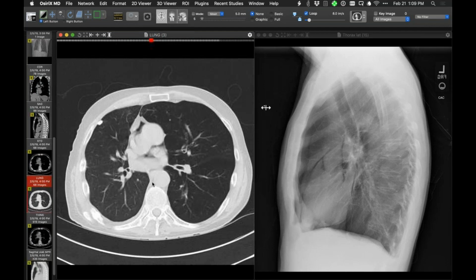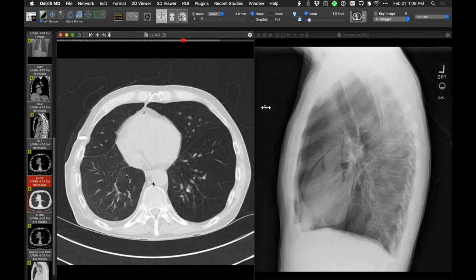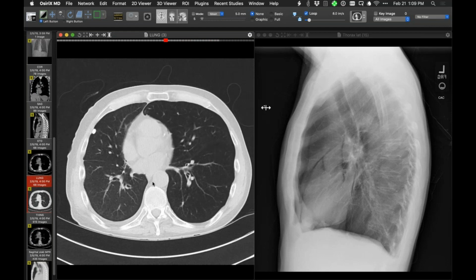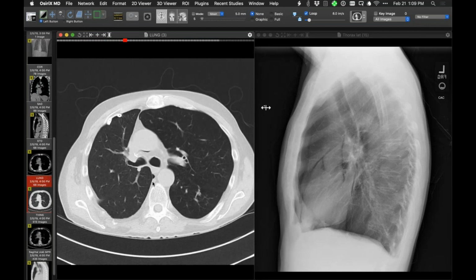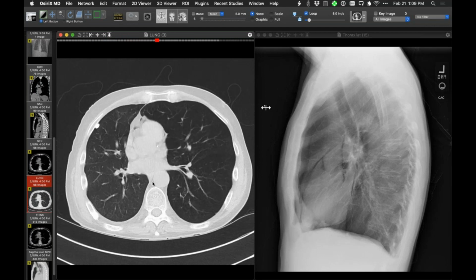So that at least there's a potential for Pneumomediastinum to go to the pleural space, or to be a communication between pleural space and mediastinum after transplantation, as well as potentially pericardium. Is that right? Yeah, you would probably get all three, because there are surgically created communications between them.